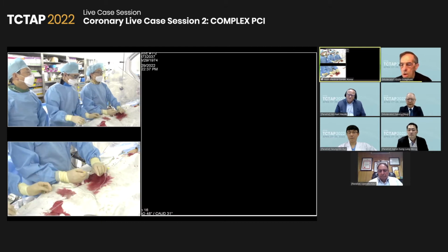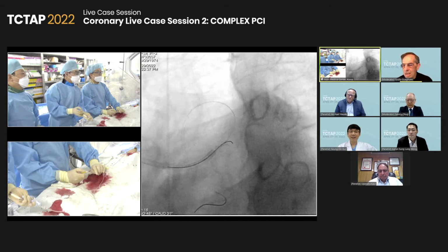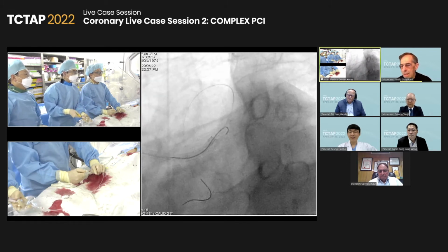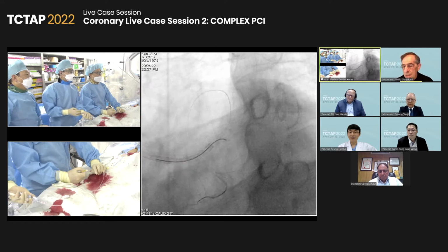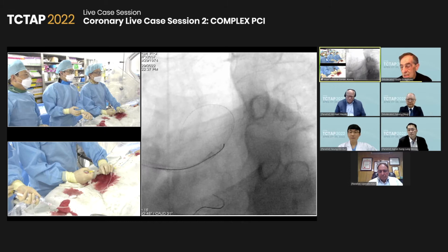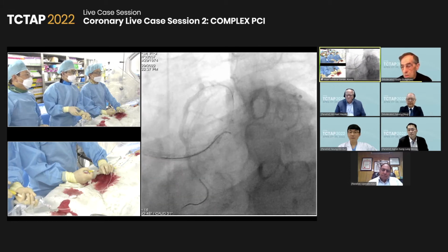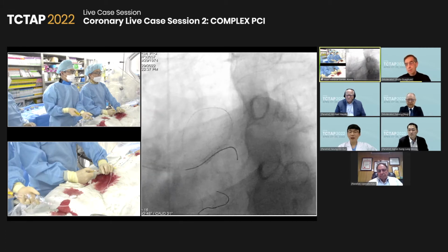Okay, so Dr. Hope, you were in favor of checking the circ, and now it's becoming clear that for the future, because he's a younger man, it's going to be very important to keep open the access to the circ, because the circ has already pathology. Do you want to comment on that?